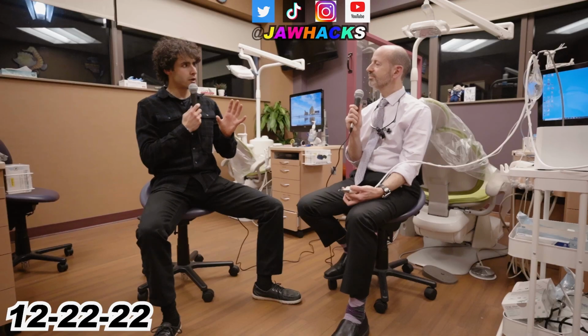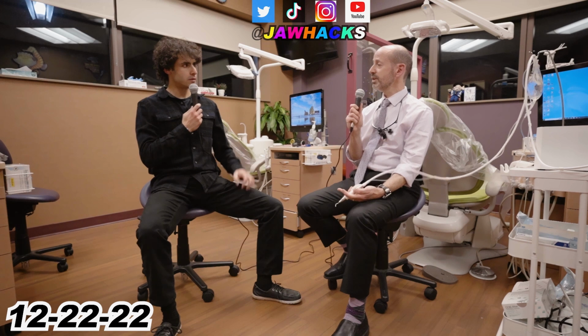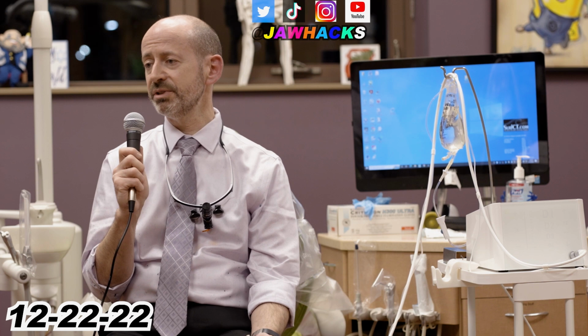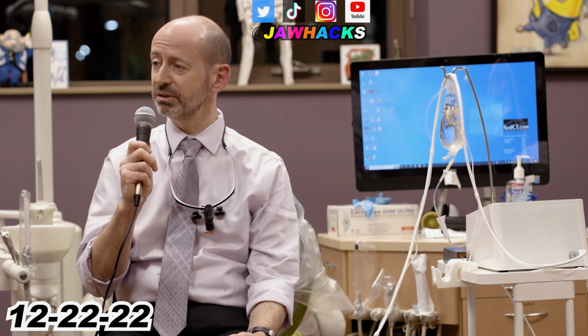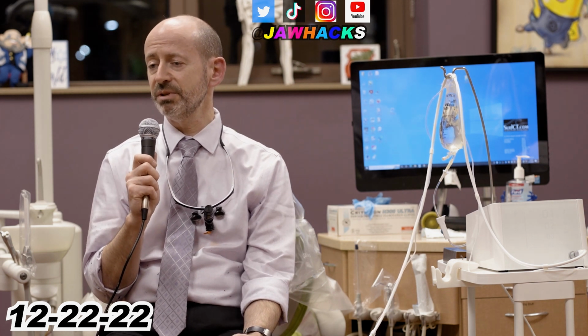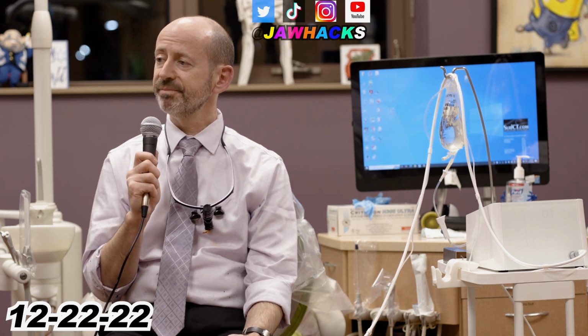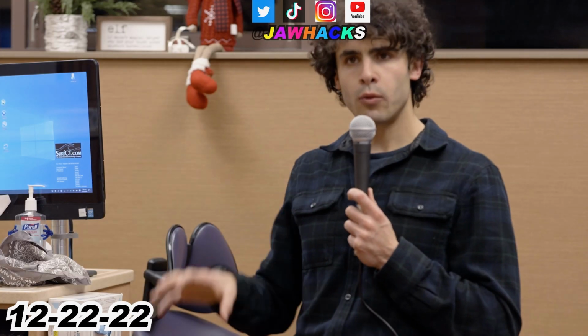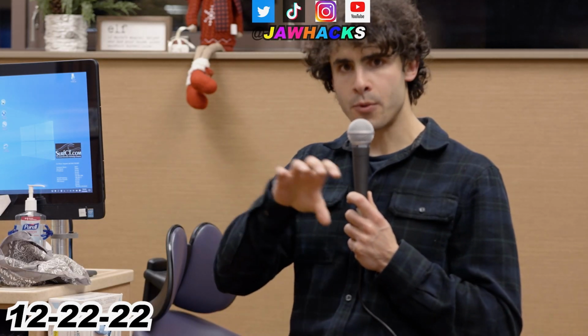So what do you see on the scan that dictates where the appliance goes? Where the bone is and the thickness of it. And do you want to put the appliance sort of in the thicker area? Yep. Not necessarily the appliance itself, but sometimes you need to add more TADs, or you need to have some supports on the sides in addition to along the midline. To make it properly successful, because sometimes the bone in the palate in the middle is too thin. So is the idea you want to put the appliance in the area where it gets the most bite? Pretty much. That way the TADs don't drag through the bone.